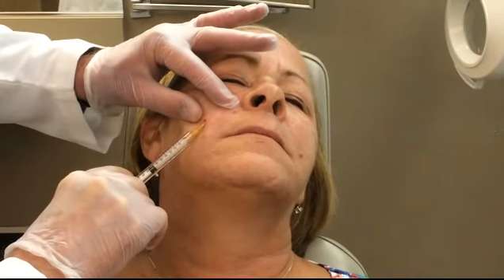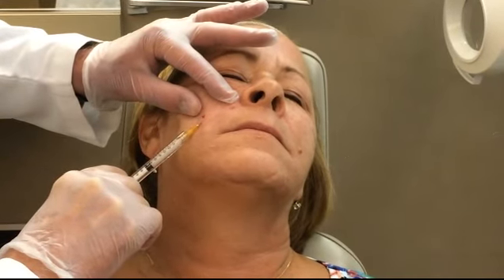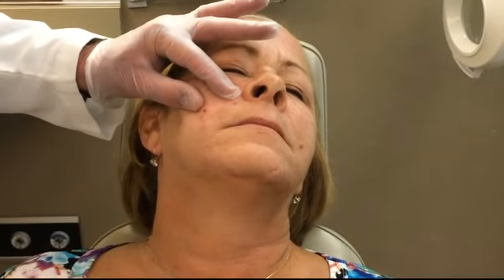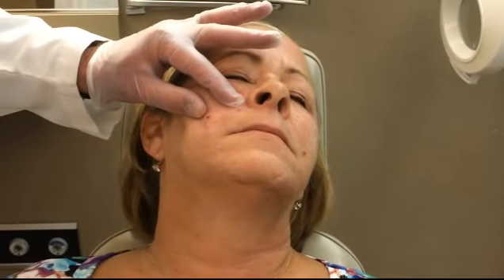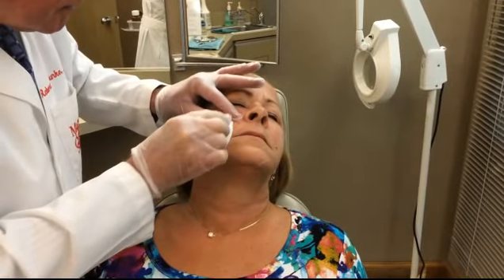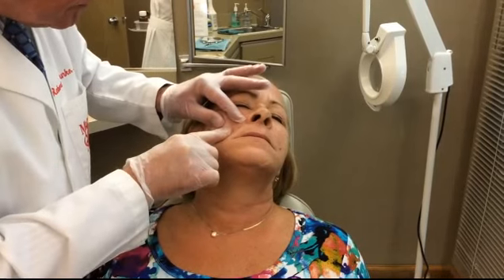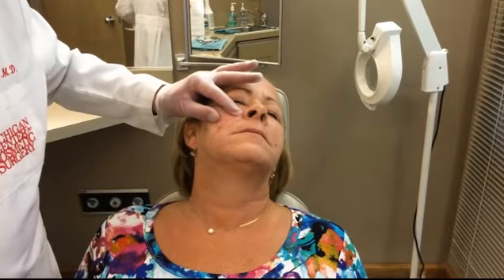As time goes on, you might feel a little bit numb in the area. We're doing just great. Now we're going to stop right there. We're going to just gently massage it and we're going to continue.